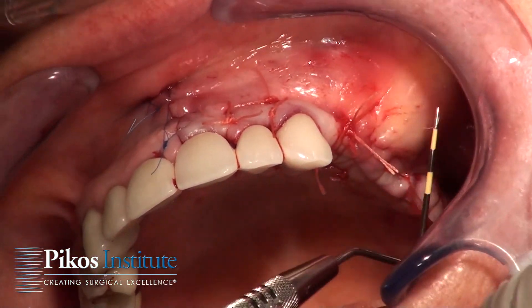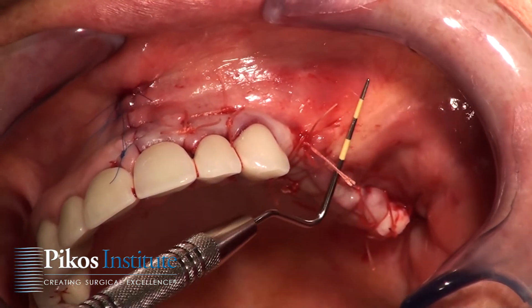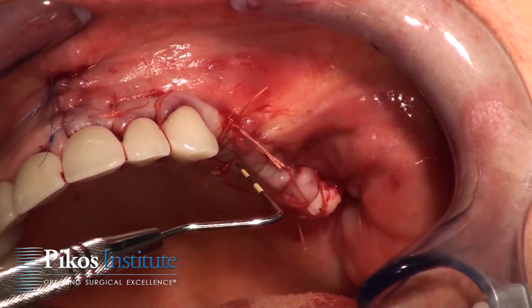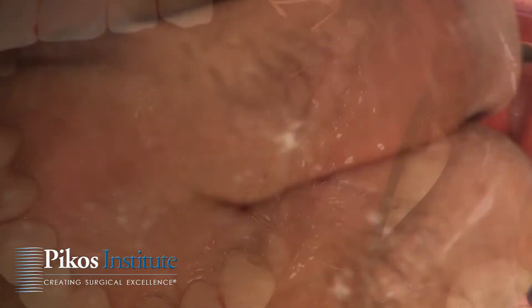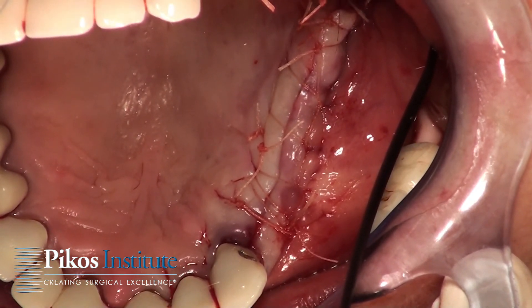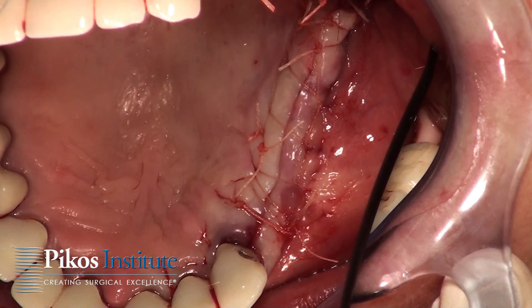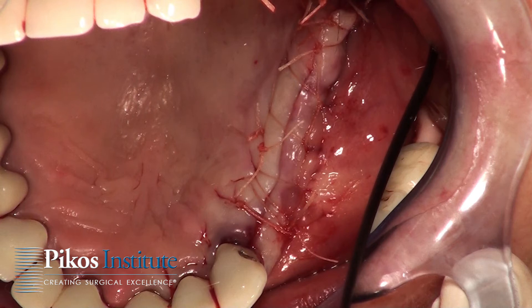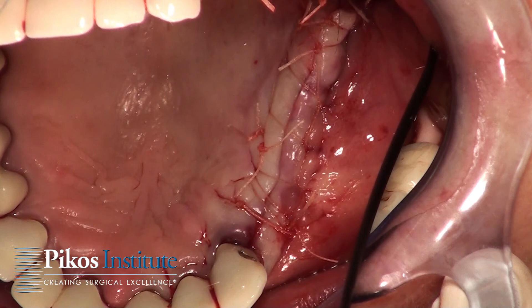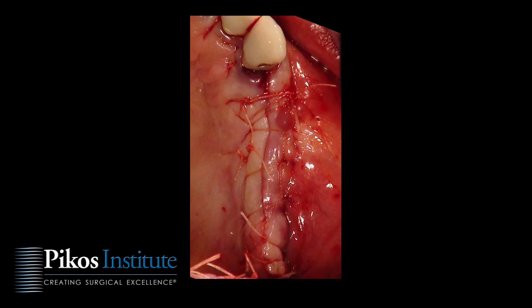Here you can see we've got primary closure now without tension. Our augmentation, as you can see, is visible right in through here, and we've got good primary closure throughout the crestal area. We can see great primary closure with no problem — we can release quite a bit of the flap from the buccal only. We'll be waiting approximately four months for this augmentation to turn over and for the graft to incorporate well enough for implant placement, and we'll reevaluate with Conebeam CT prior to implant placement.